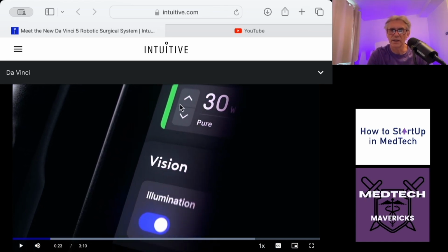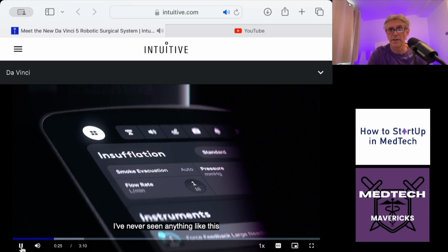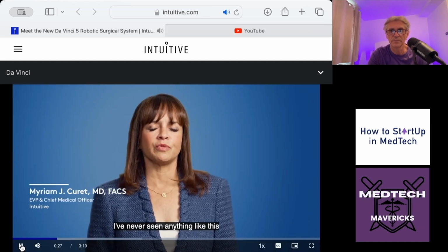And here you can start seeing things like on the hub, where those beautiful graphic interfaces, very iPhone-y, have come into things like the hub. So no matter where you sit on this system, you'll see some. I didn't understand it when I first saw the graphic, but having been on the system and played with the system, I now understand it a bit more. There's the hub there.